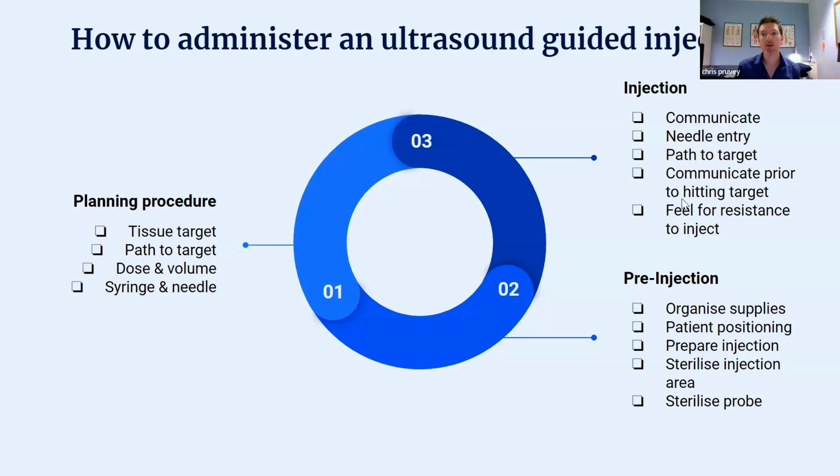So communicating with the patient is a good idea. These aren't hugely painful procedures. They're really not. And if anyone is having, occasionally something's going to be sore, generally we can use some local anesthetic on the way down. It just takes a bit longer for patients.